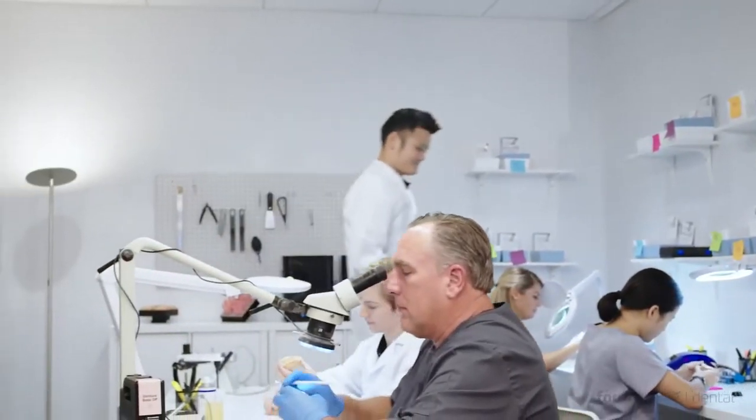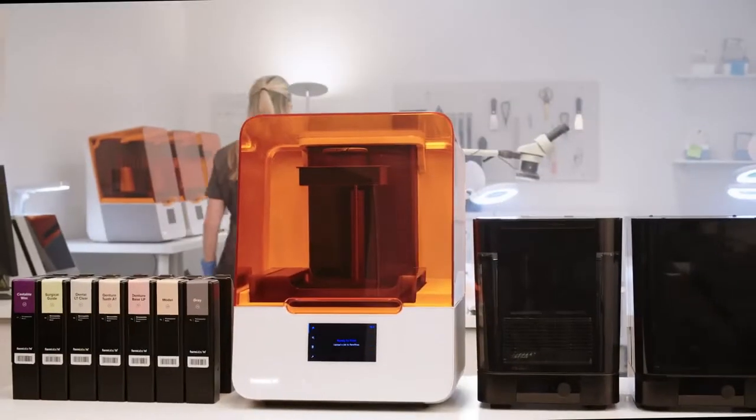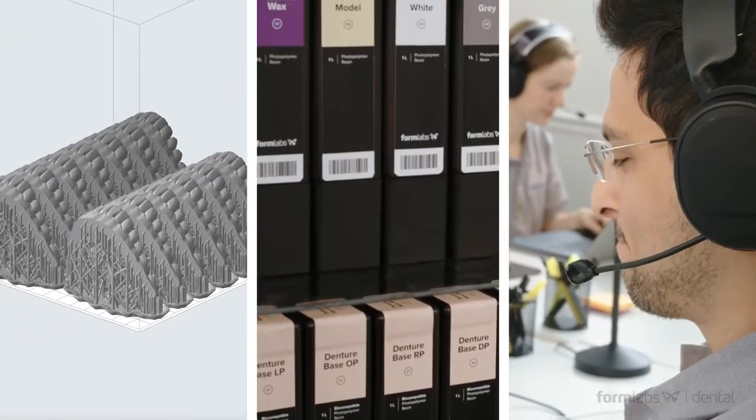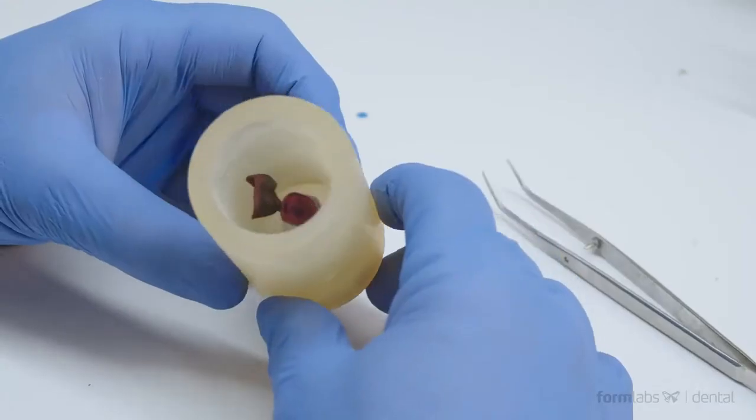Dental laboratories represent one of the most demanding segments of the dental industry. The Form 3B builds on all the great features that made our Form 2 printer a hit with major dental labs all over the world, and adds a suite of powerful new features and services that will enhance your workflow and make you proud of the parts you're delivering.